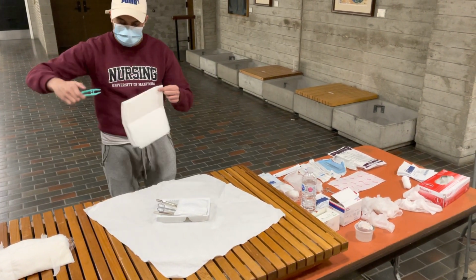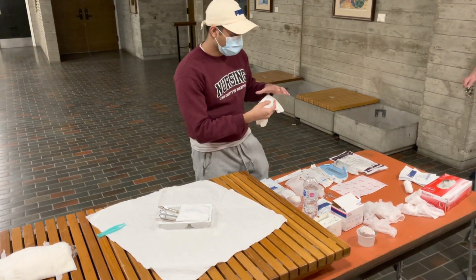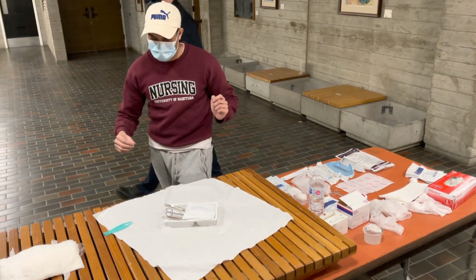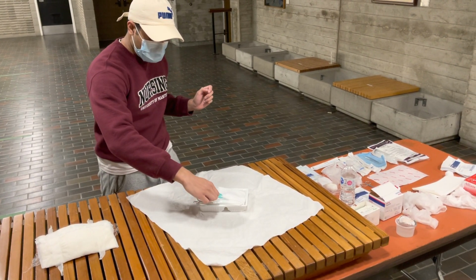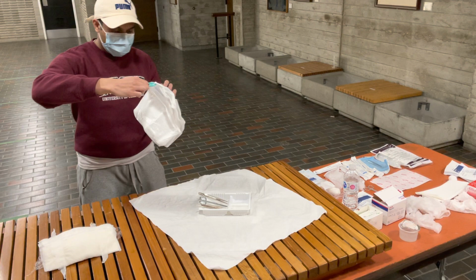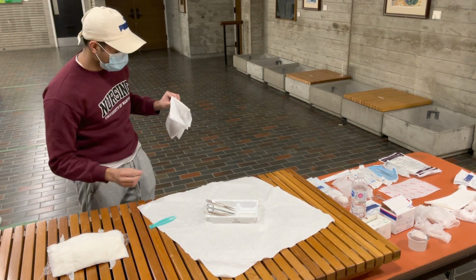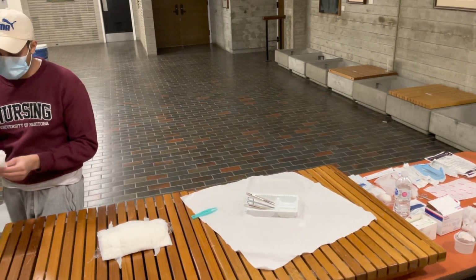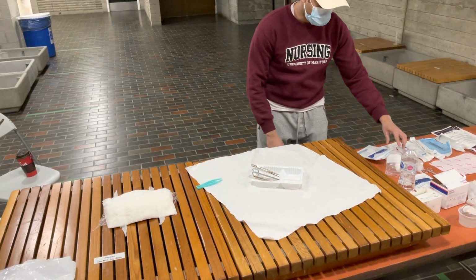Has to drape over. We don't need this, so we're just going to put the garbage there. We asked our patient if it's alright if we just place the garbage right by the patient's bedside. So they said sure. So what we're going to do first is add our supplies.